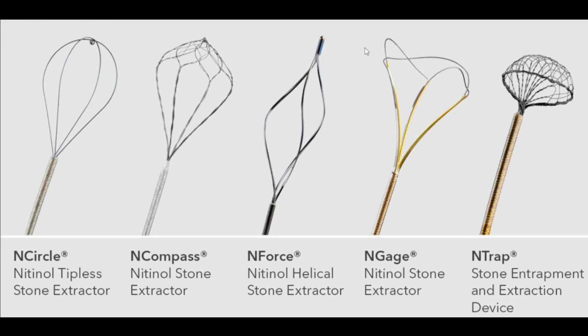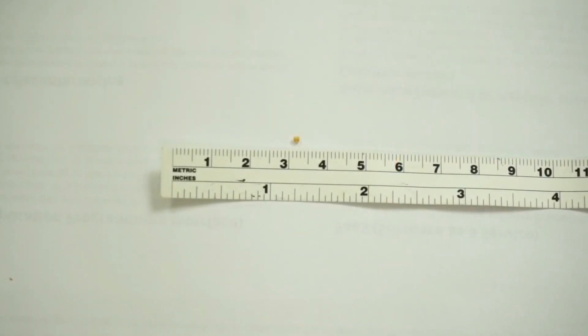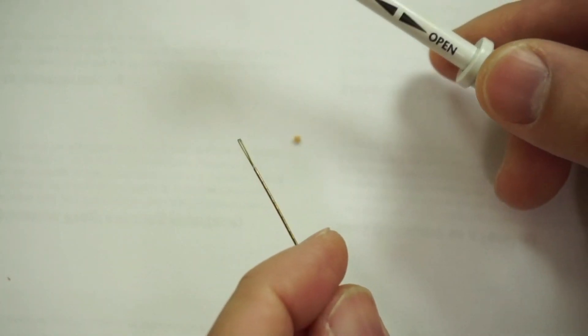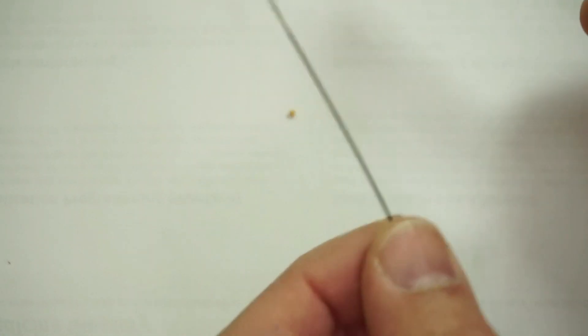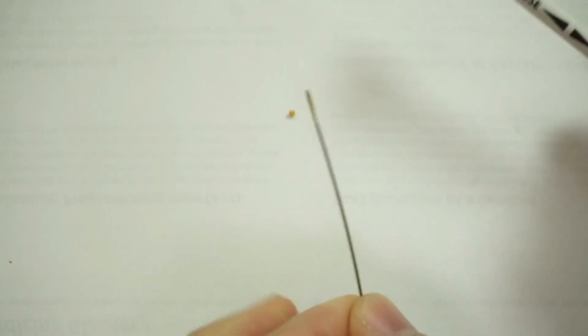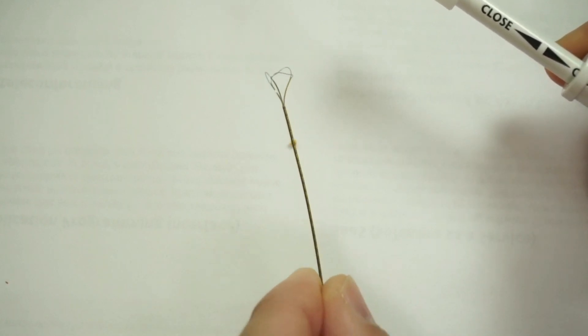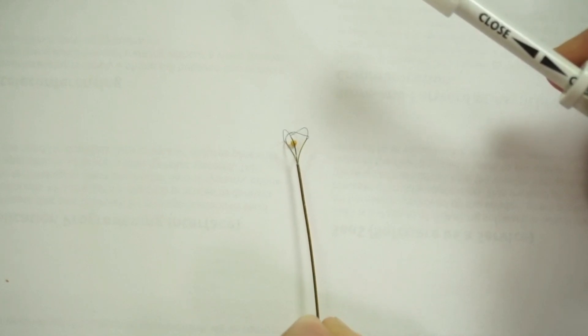Let me show you a quick demo of how this thing works. This is actually a two-millimeter stone that I have on a piece of paper — it's pretty darn small. I'm going to bring in the Engage stone extractor. This is on a piece of paper on a little bit of a tilt. Imagine the stone is in the ureter and you're trying to get to it using the stone extractor. I can open it and retract the stone distally to where that ureteral stone is.